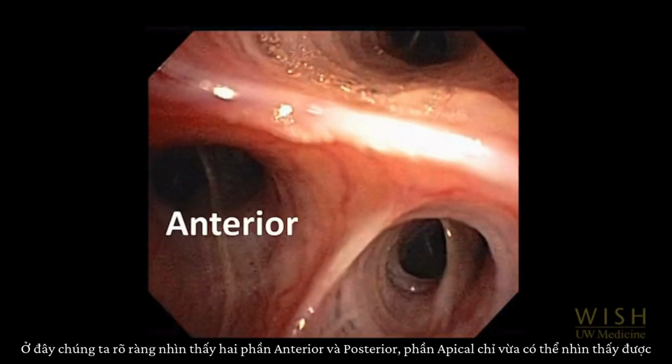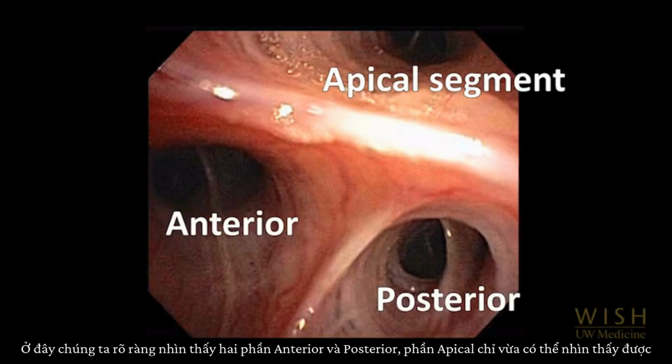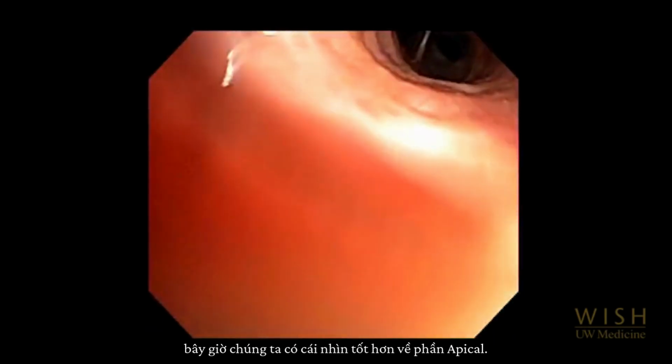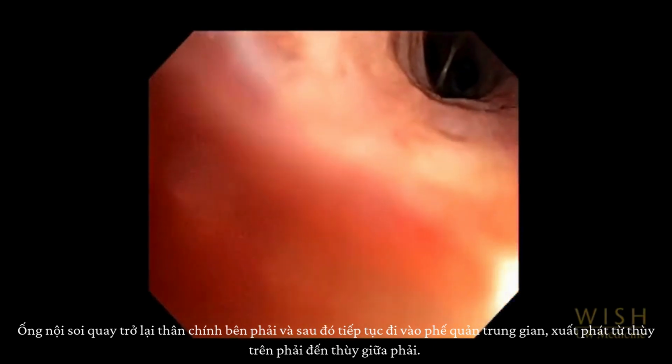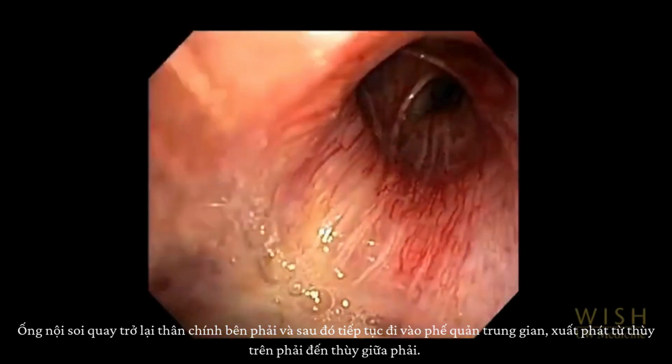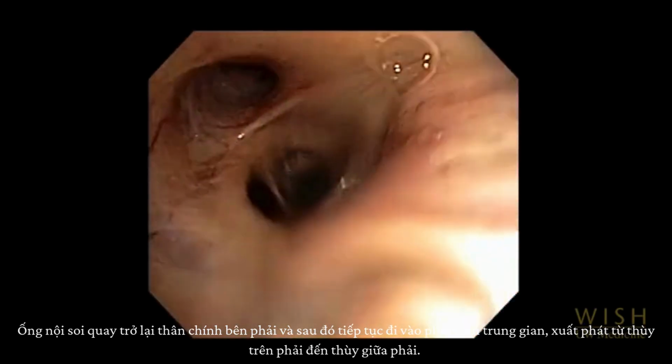Here we clearly see the anterior and posterior segments. The apical segment is just visible. Now we have a better view of the apical segment. The bronchoscope returns to the right mainstem and then continues into the bronchus intermedius, which runs from right upper lobe takeoff to right middle lobe takeoff.